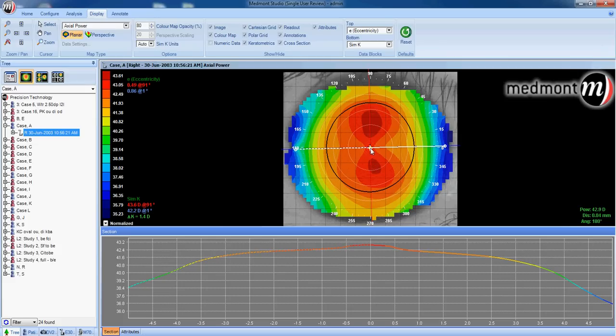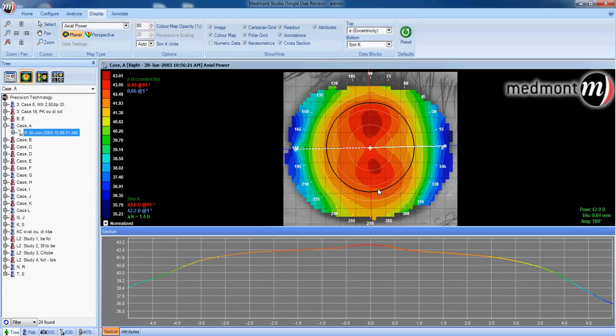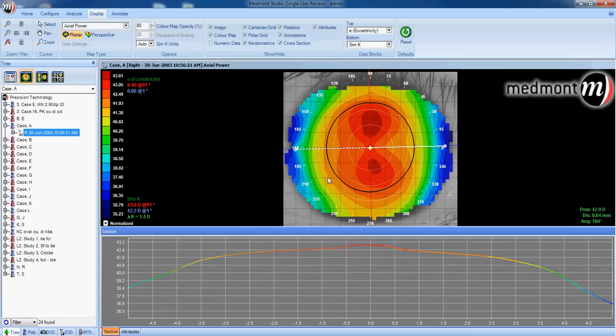We could look at the 3-millimeter, 5-millimeter, and 7-millimeter white rings, and the pupil, which is in black here. We can use either the pupil or the rings to determine the position, shape, or size of any anomalies in relationship with the visual axis, with the pupil, or to a certain diameter away from the apex.